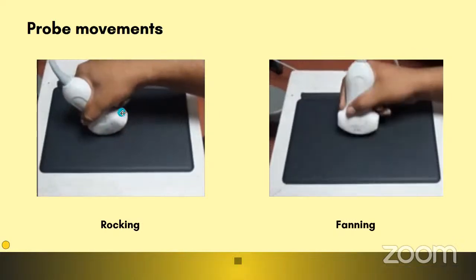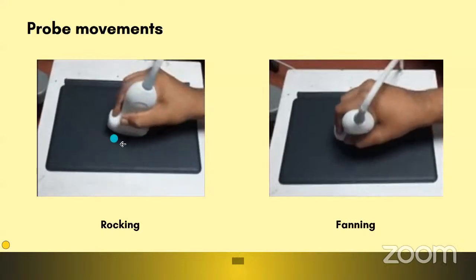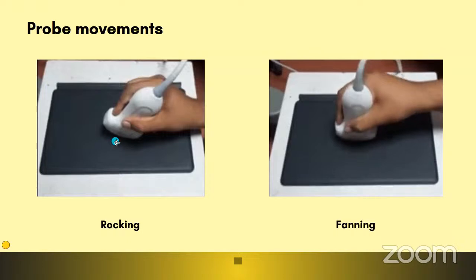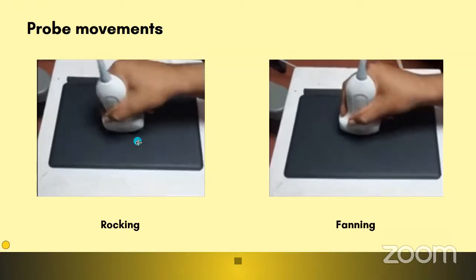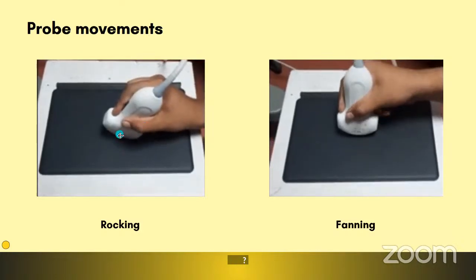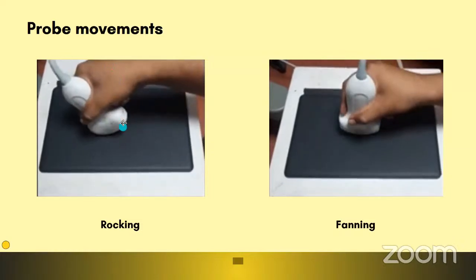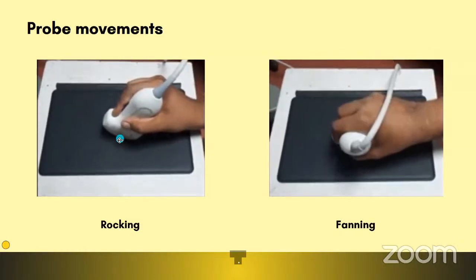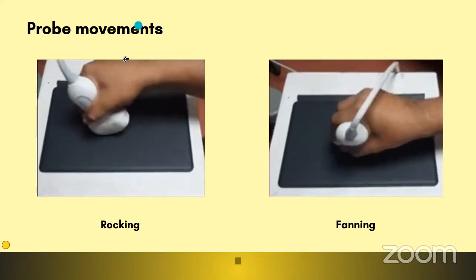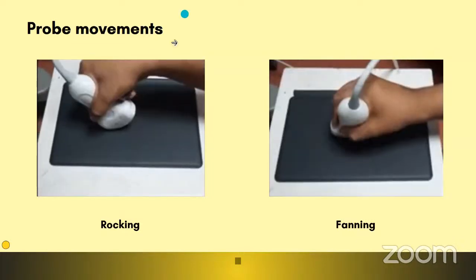The term rocking is applicable in the case of curvilinear probes as well as echo probes because of their curved transducer area. In this curved path, as you have seen rocking chairs in your life, it's like fixing the probe on a specific area of the body and just rocking to and fro in order to appreciate the structures which are cephalad as well as caudal to the area.